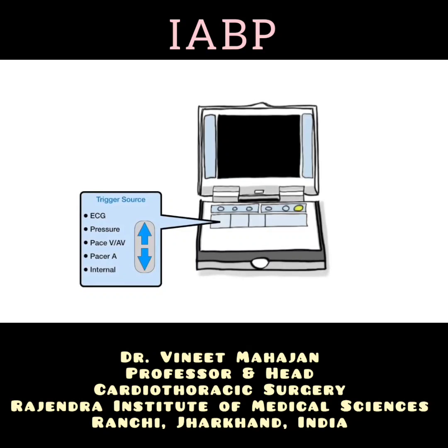Trigger is the signal the balloon pump uses to identify the next cardiac cycle. It is a deflation signal. When the balloon pump recognizes the trigger event, it will deflate the balloon if not already deflated. There are 5 different ways to trigger. ECG is the most commonly used and preferable triggering modality. It uses the R wave to trigger balloon deflation.